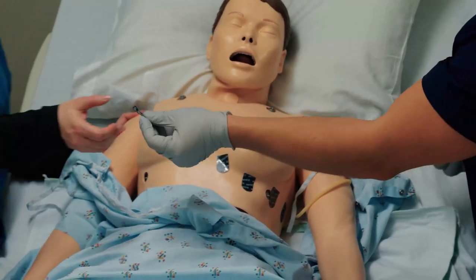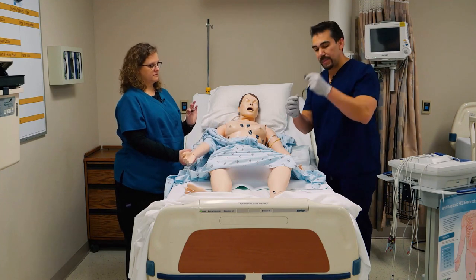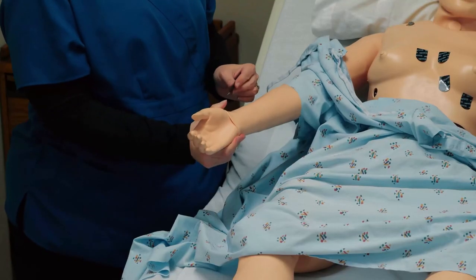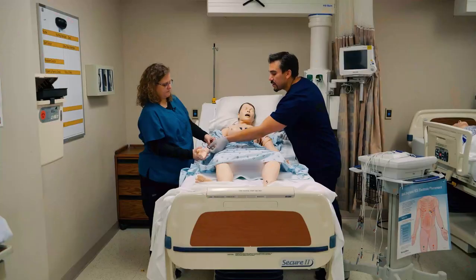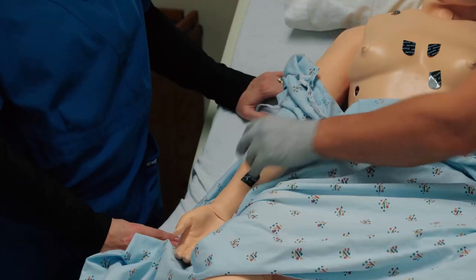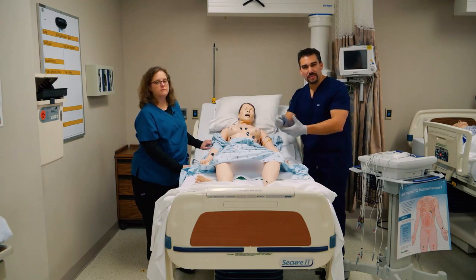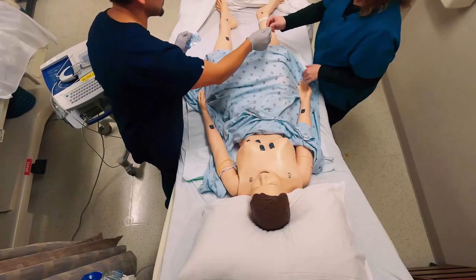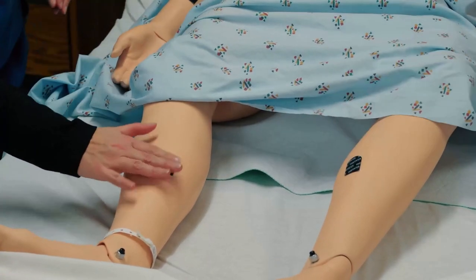When placing the extremity leads, make sure the lead goes back up toward the heart. We want to go on the inside on a good meaty part of the arm. The reason for this is that when we hook up the leads, you don't want them to wrap around the arm — you want them to lay nice and flat for a good reading. And for the legs, go around the meaty portion of the calf. Some hospitals say on the foot, but the meaty portion of the calf gets a really good reading.